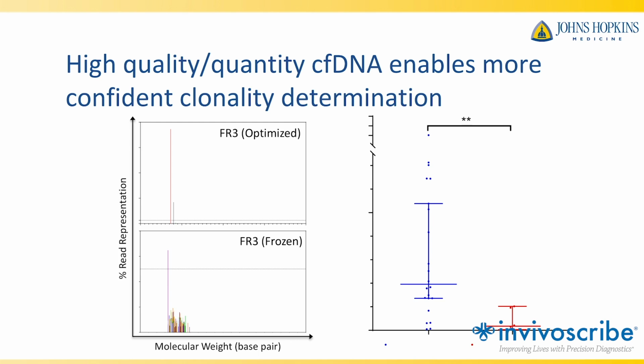And so the more reads you got may not have been cell-free DNA, may actually have been degraded genomic DNA, i.e. B cells in circulation. So we think now that you have a clean background, the clonal dominance becomes much more apparent.